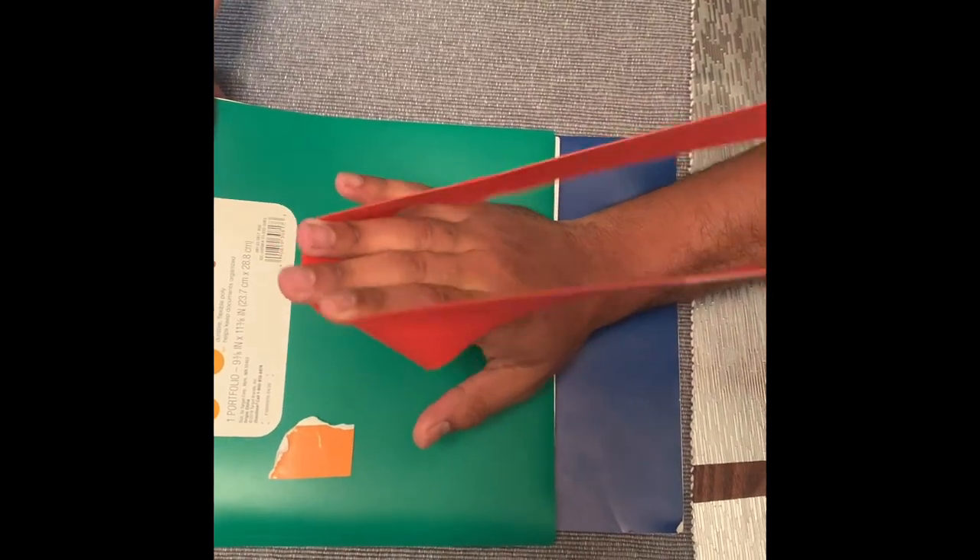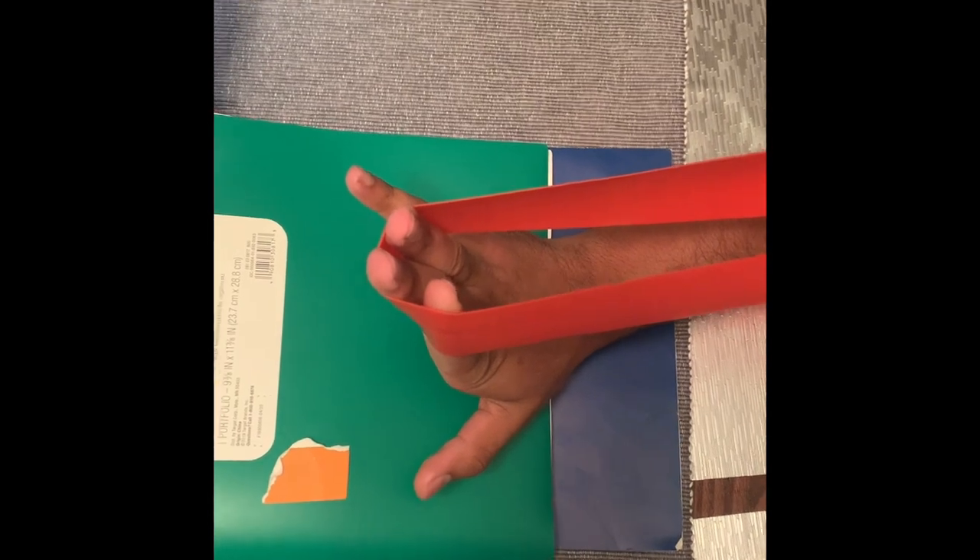Pull back, don't move — click — perfect.